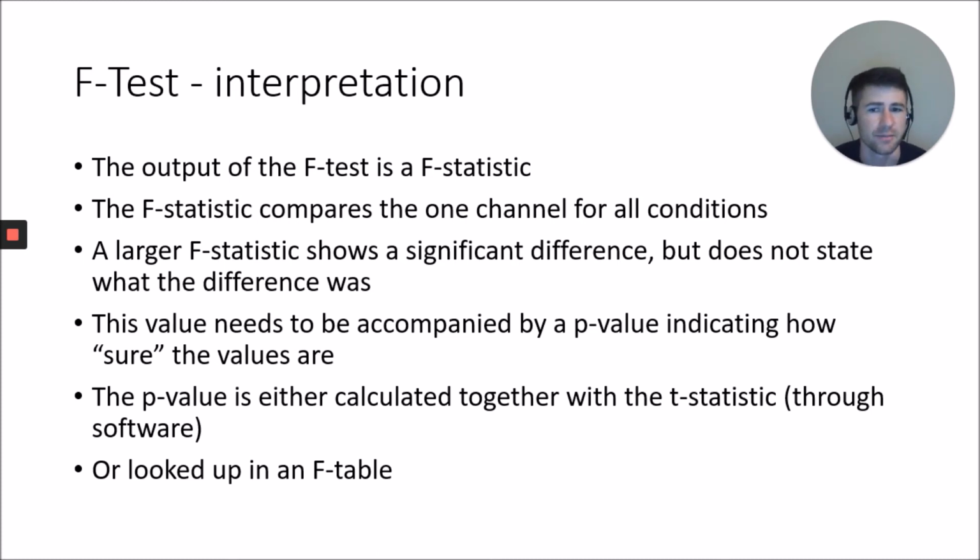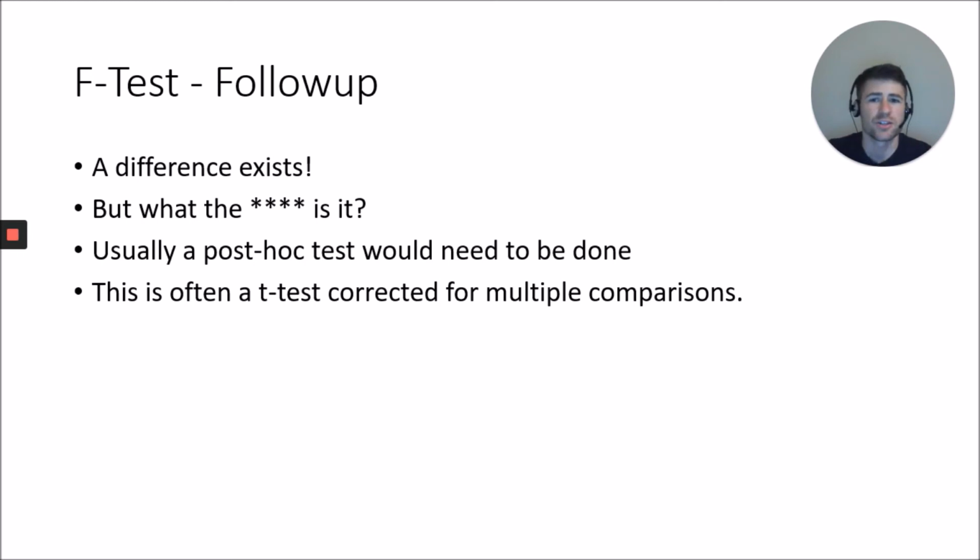And again, you'll need a p-value to know how sure these values are, and I put sure in quotations. Again, any software used will likely calculate the p-value with you or for you, or you can look up an F table. So finally, we have a difference. Your F-test shows significant results.